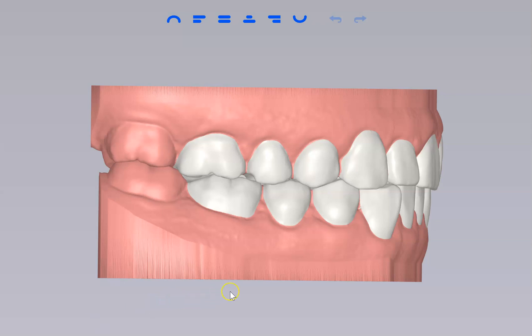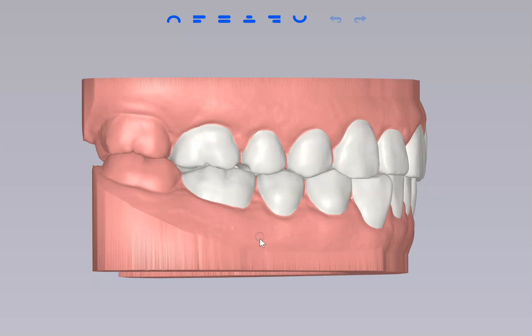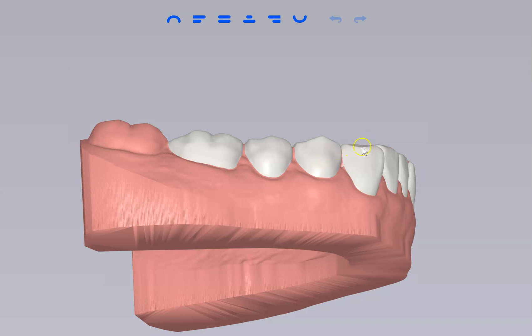I thought I'd just give you a quick demonstration of the tech we're using to fix your teeth. You can see right here, this is that area we talked about where you've got upper teeth that are clashing with lower teeth. You can see that the lower teeth right there have kind of been scooped out in that area — that's where the damage is.